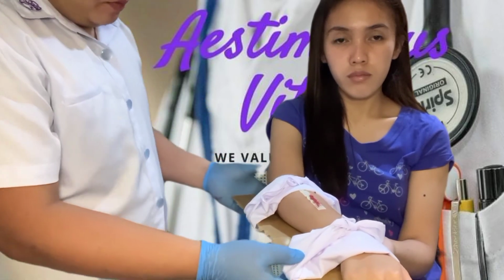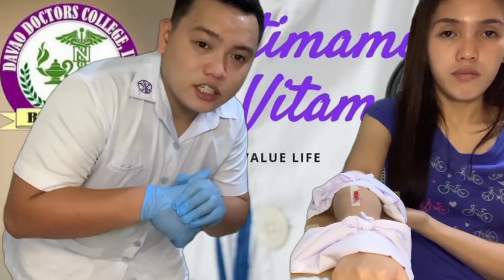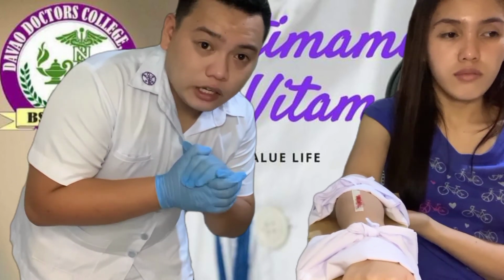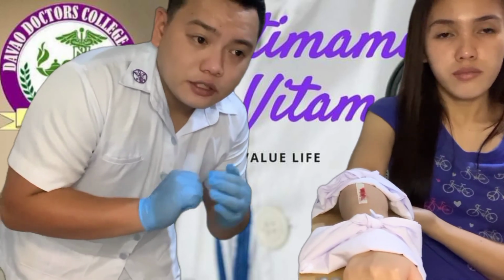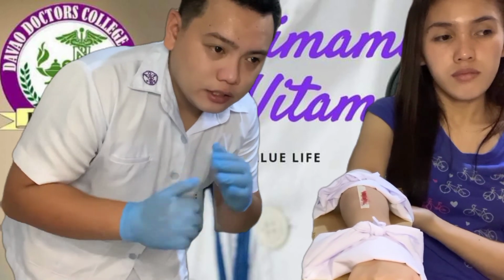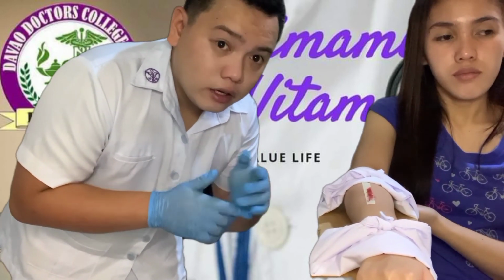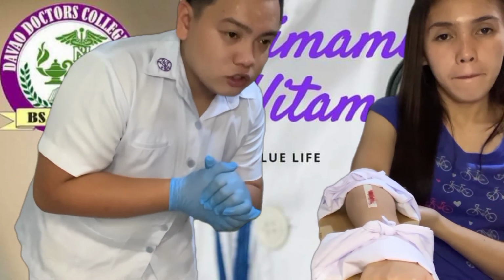So I'm done. So next step. After securing the bandage, we need to recheck for circulation. So we need to check for feeling, check for warmth, and check for color. Rationale for this is to guarantee that the bandages are not too tight to block or impede the circulation of blood around the injured area.